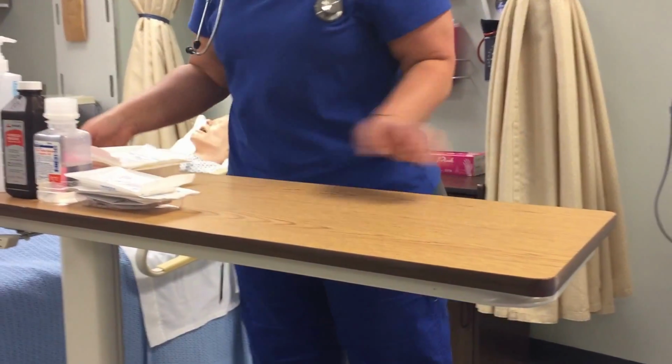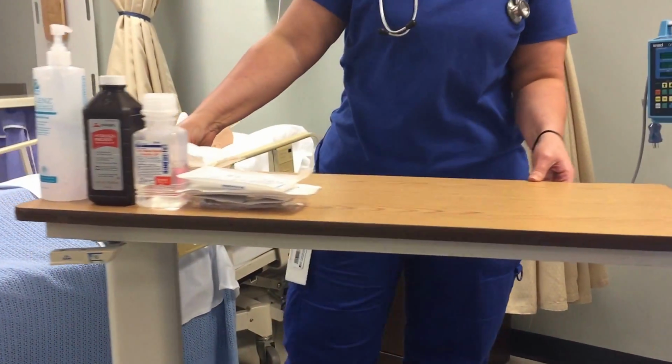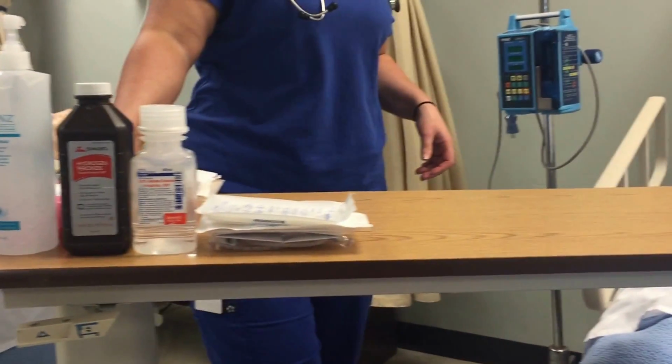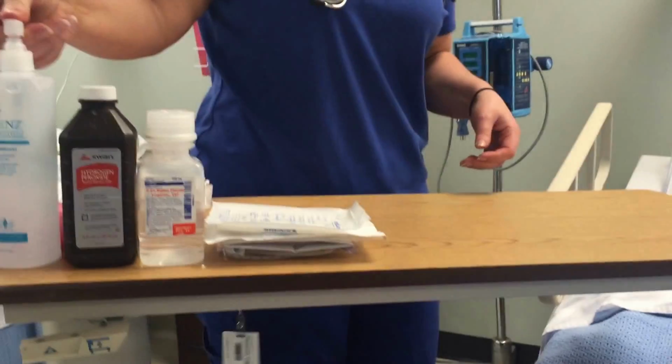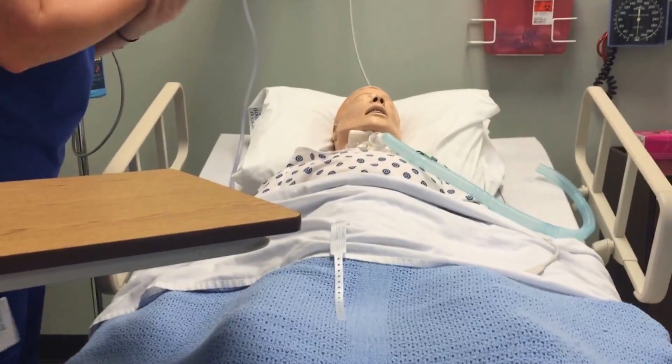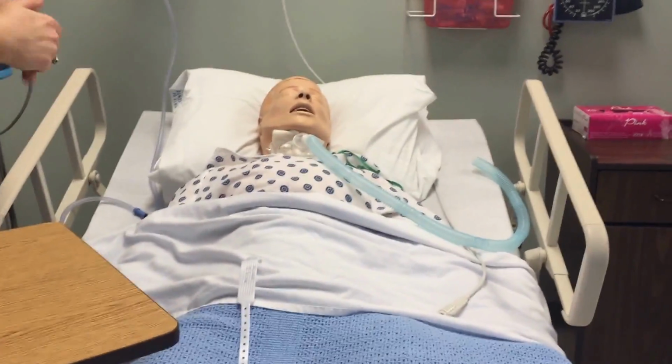All right, so come into the room. Hello, Miss Dan, how are you doing? My name's Amanda. I'll be your nurse today. I'm going to do trach suctioning and your trach care today. Just make sure you do your hand hygiene.